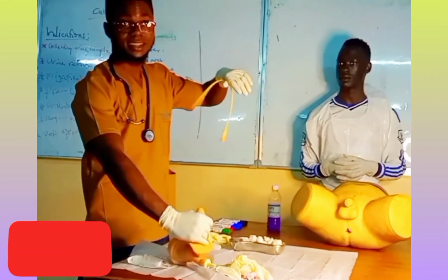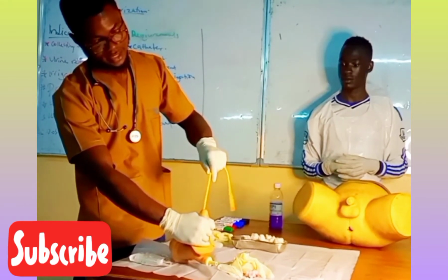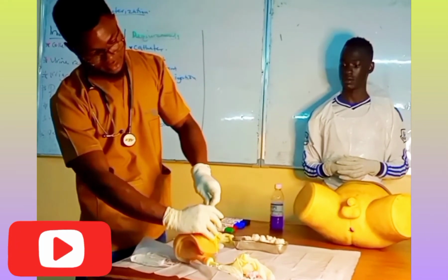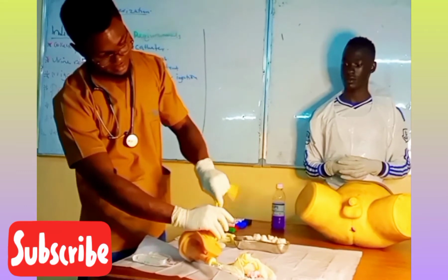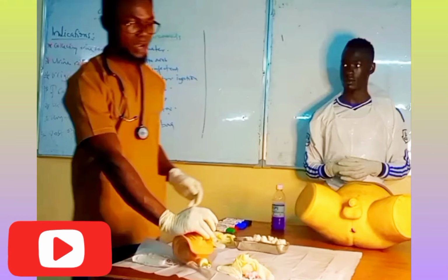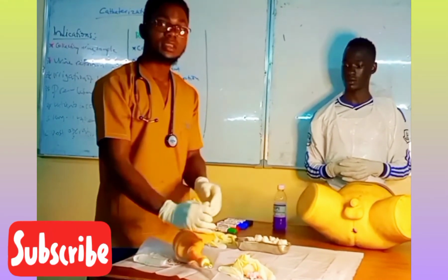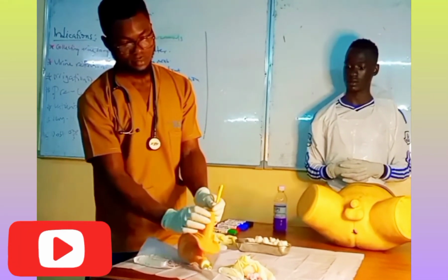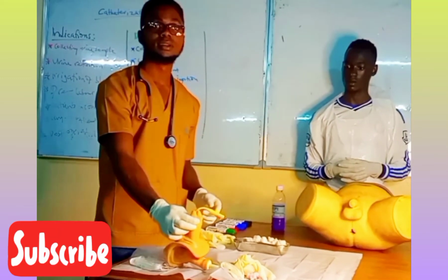Are we together? Then I start to do what? To insert within the urethra. I insert my catheter, I insert. What shows me that I'm inside the bladder, or I'm already in the bladder? For a man, you can insert this catheter up to this level. Are we together? You can insert it up to that level.